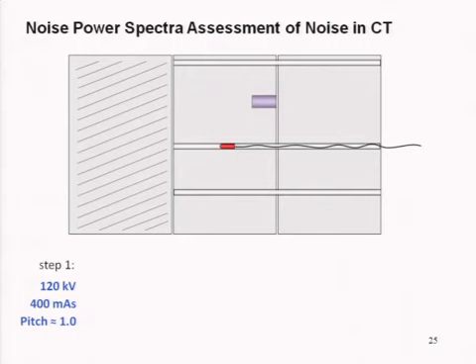So you would put this phantom on the scanner. You dial up a very high technique scan, and you image. That high technique gives you a nice, high-quality reconstructed region for you to assess MTF, because MTF is best characterized at a high-dose scan. So you've made the dose measurement as you scan through that, and whatever it was, we know that we can adjust the mAs linearly down so we can set a dose.